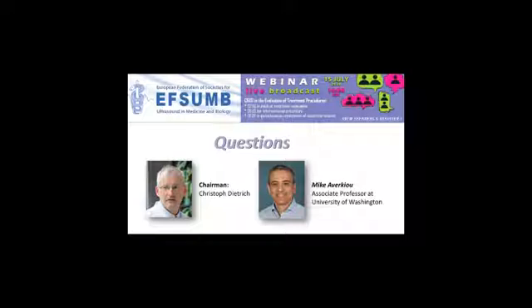So that is a very good and a very difficult question, because I wish I could give a specific answer that would be good for everything. However, what I typically do is look at the lesion together with the radiologist, and we make the evaluation whether we're going to include the whole lesion, including the necrosis, or just do the ring around the lesion.